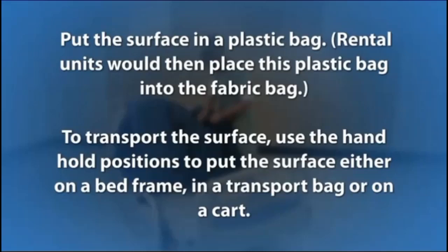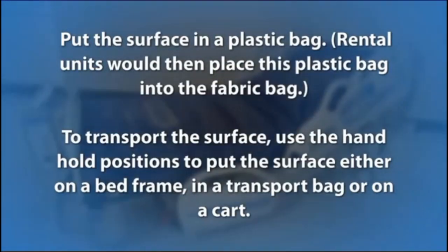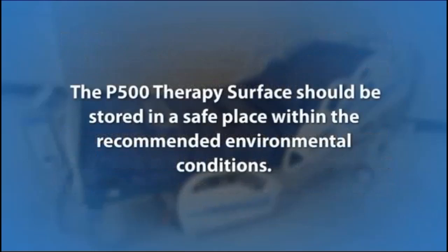To transport the surface, use the handhold positions to put the surface either on a bed frame, in a transport bag, or on a cart. The P500 Therapy Surface should be stored in a safe place within the recommended environmental conditions.